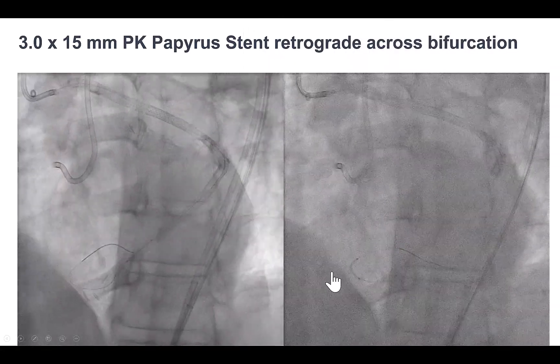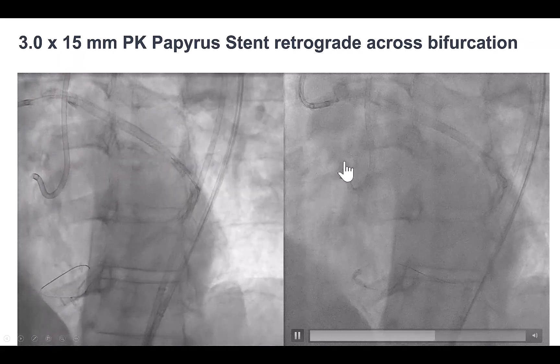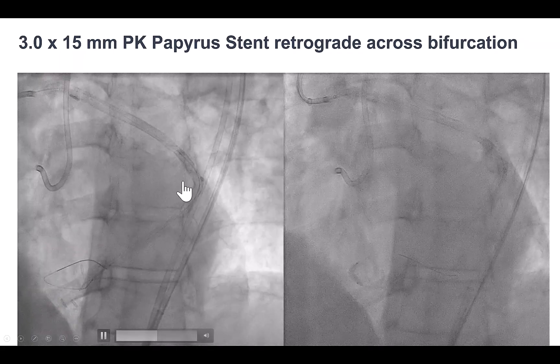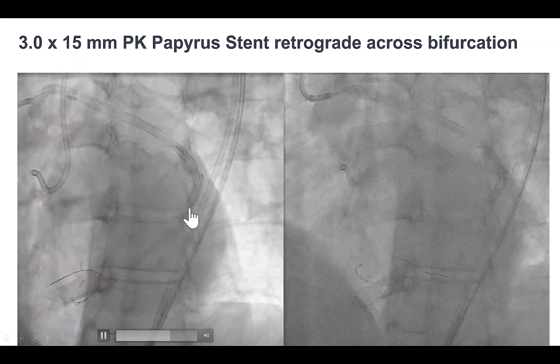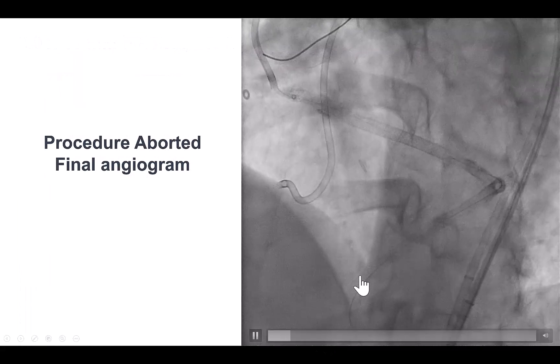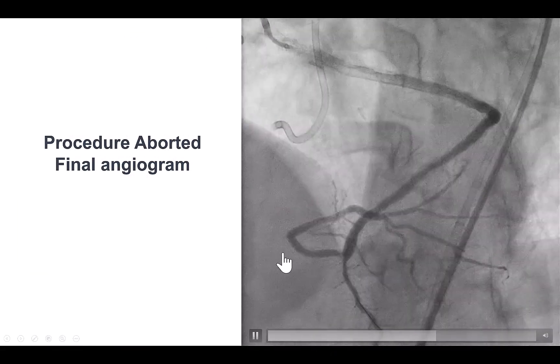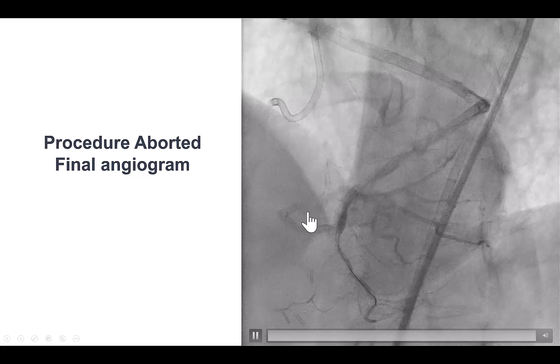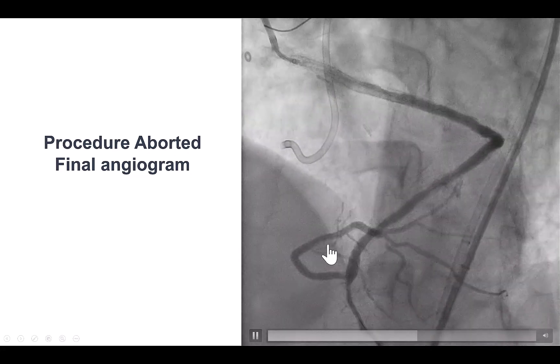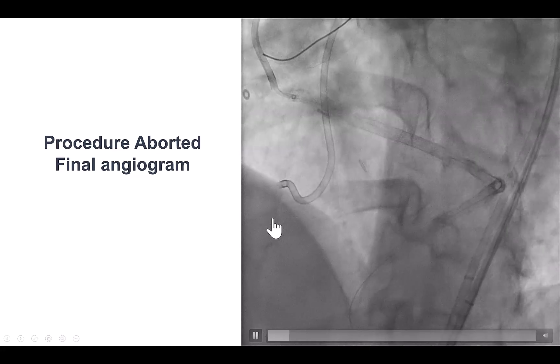We were able to deliver a covered stent. Delivery was very challenging but was successful using a guide extension. A PK papyrus was deployed across the bifurcation and successfully sealed the perforation. However, this covered stent was now placed essentially across the distal cap of the CTO.